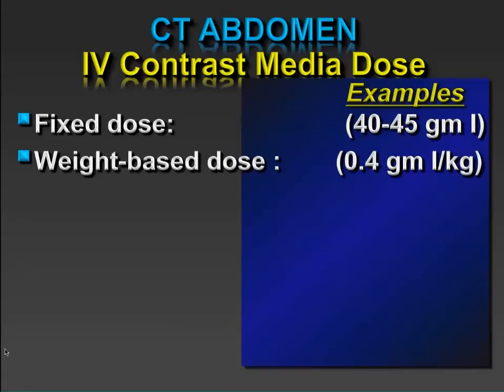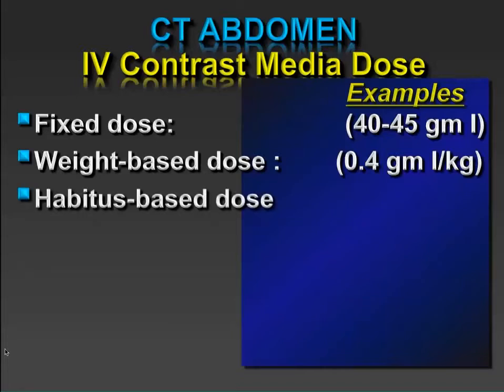And there's a good reason for that, and that's because although fat may be substantial in some patients, fat doesn't really get that much blood flow relative to the volume of tissue. So as a result of that, most of the contrast media that we get goes to our lean body tissue. So it's a simple way of doing it, but it's not terribly effective.